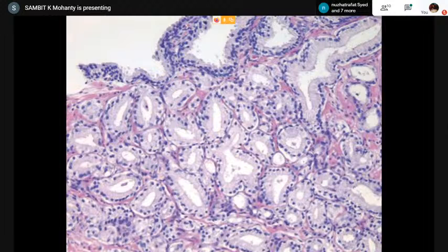This is a cancer which looks like adenosis. You can have a problem. Here the nucleus is not hyperchromatic, and there is no blue mucin at all in this case. And there's a single nodule, no infiltration, and some benign glands. This benign gland and the cancer cells with basal cells here look very typical. So here you definitely need stains to answer.